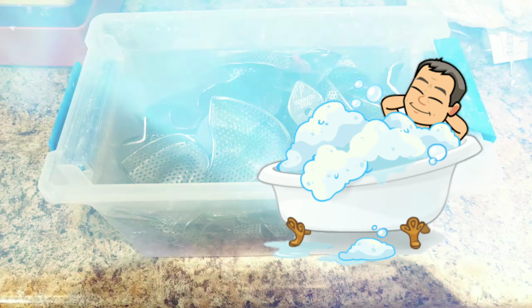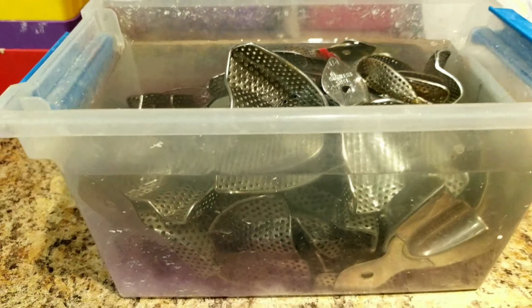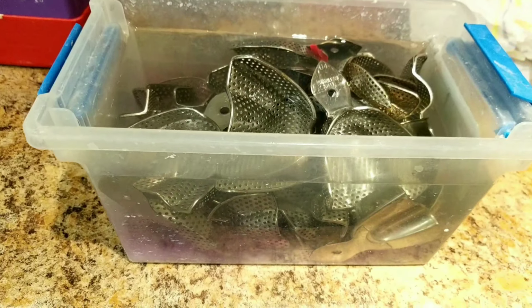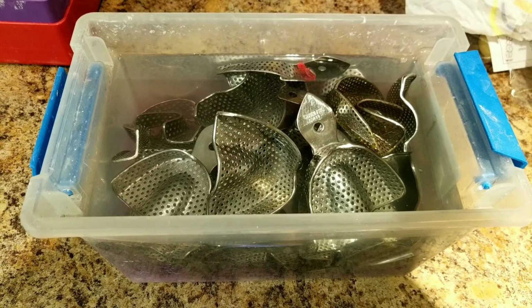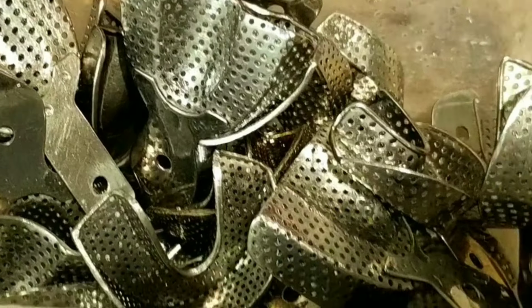So this is after I put them in there at night and left them overnight, and this is the morning. This is about 10 hours later. I'm going to drain the chemical and rinse them off real fast. So I just strained the liquid, and this is what they look like.